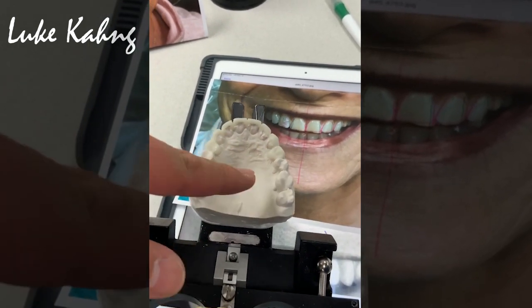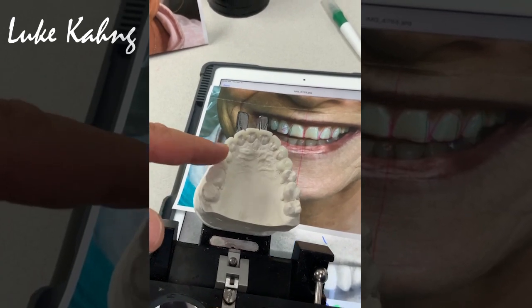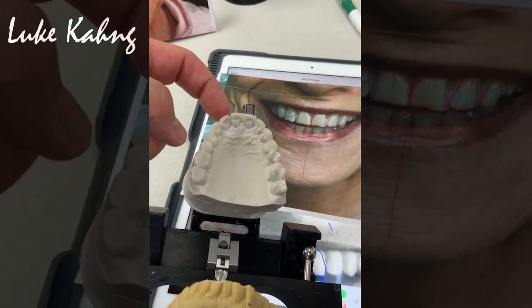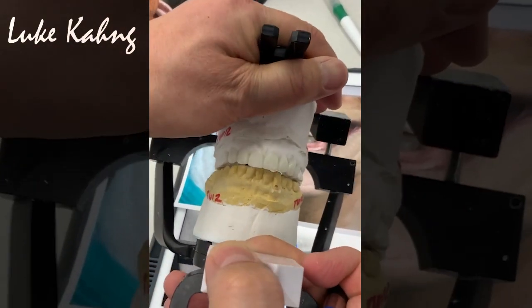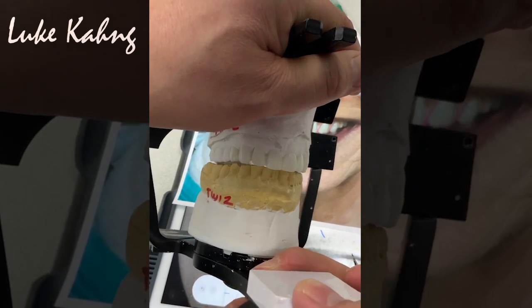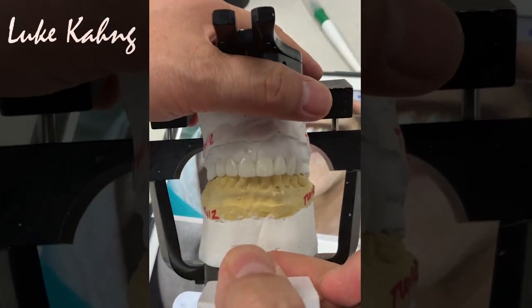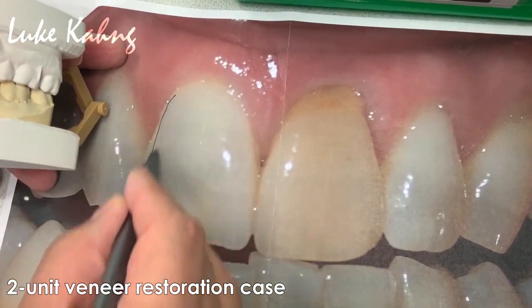This is a crown, the patient had. This is a big amalgam, the patient had. So I recommend crown and crown. This is 3/4 veneers because they have to prep way more distally. Then I move to the side of the tooth. That's the combination for the treatment plan wax up. Okay. Alright, so 2 unit restorations.